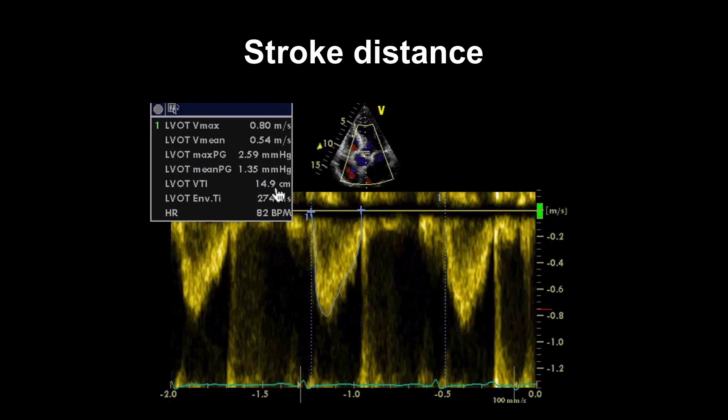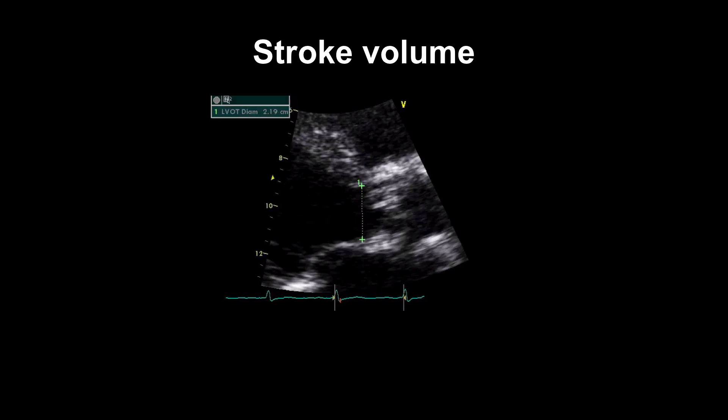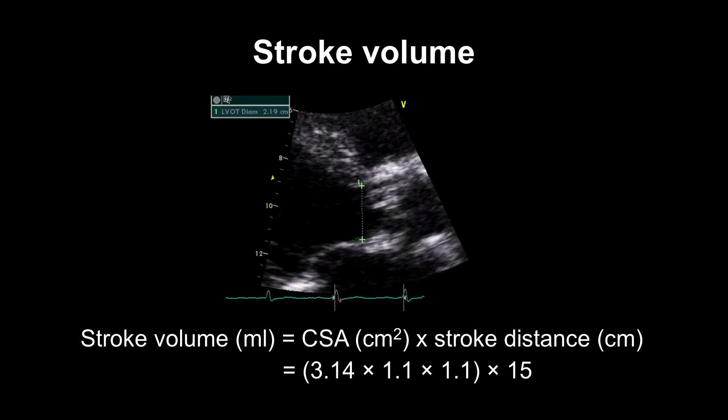Velocity time integral and stroke distance are the same thing, and the terms tend to be used interchangeably. So let's move on to stroke volume. So what we're doing here is we're measuring the diameter in the left ventricular outflow tract. It's giving us 2.2. And we're using that to work out the cross-sectional area using pi r squared and multiplying it by the stroke distance.